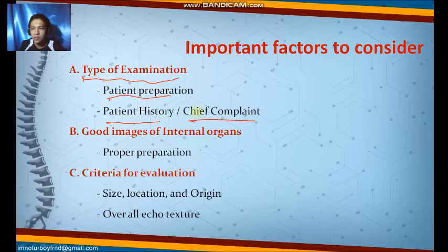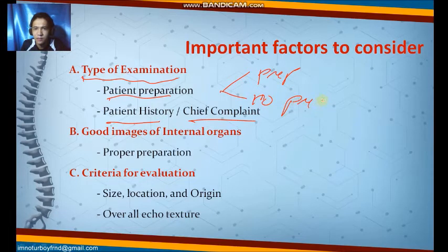Of course, it's always necessary to know if the ultrasound examination requires preparation, or if no preparation is required. There are some examinations that do not require preparation, like for example, the scrotal examination, the breast examination, and thyroid examination.